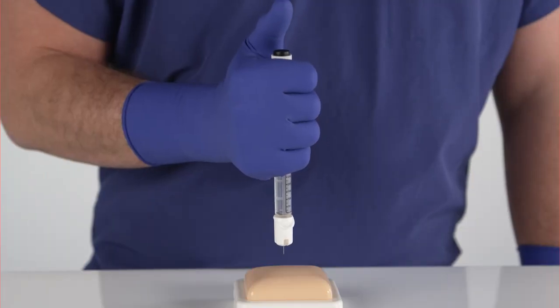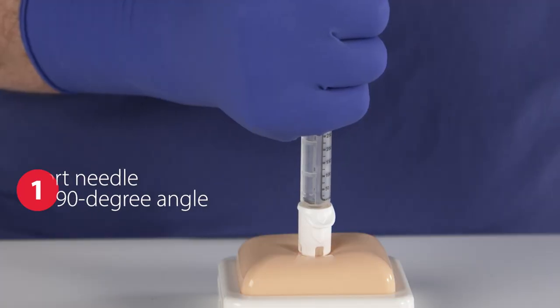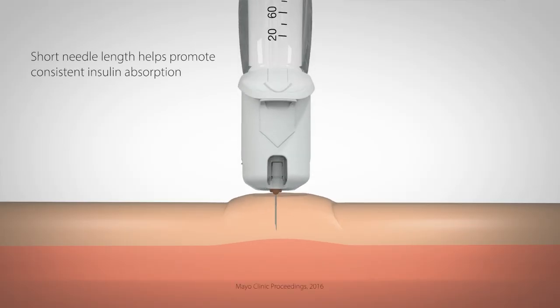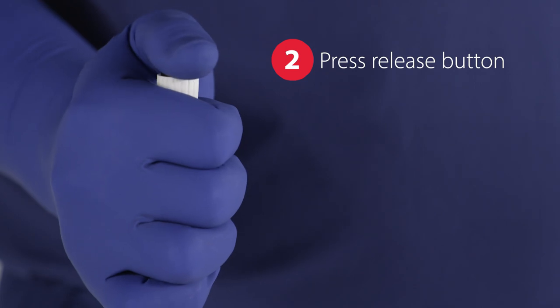Begin the injection by inserting the needle into the skin at a 90-degree angle. The short needle length allows for injection into the subcutaneous skin layer for consistent insulin absorption. Press the release button on the pen while applying constant pressure.